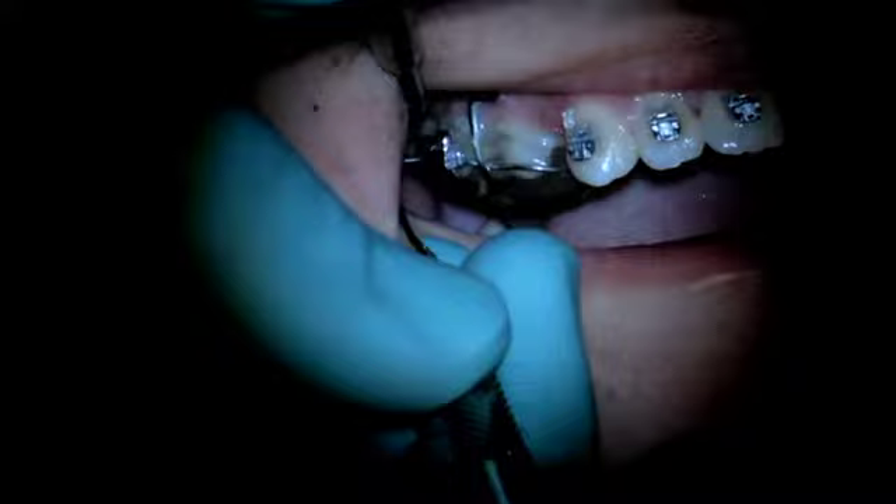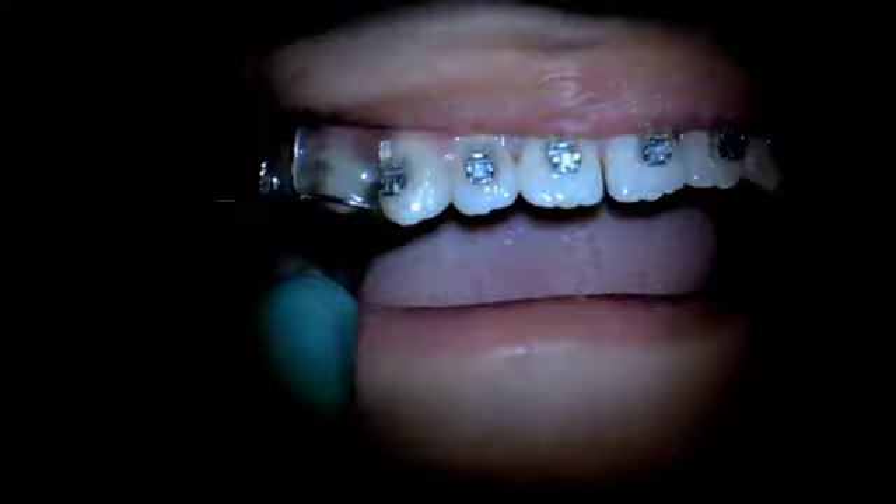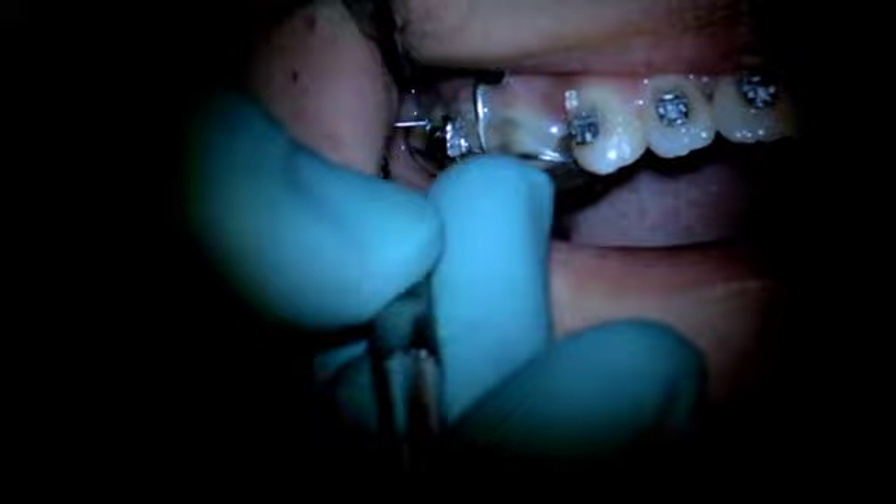So we're behind the reversible face mask hook and we're getting anterior leverage. After we've done anterior leverage, we will have to go right at the back of the hyrax and do posterior leverage.